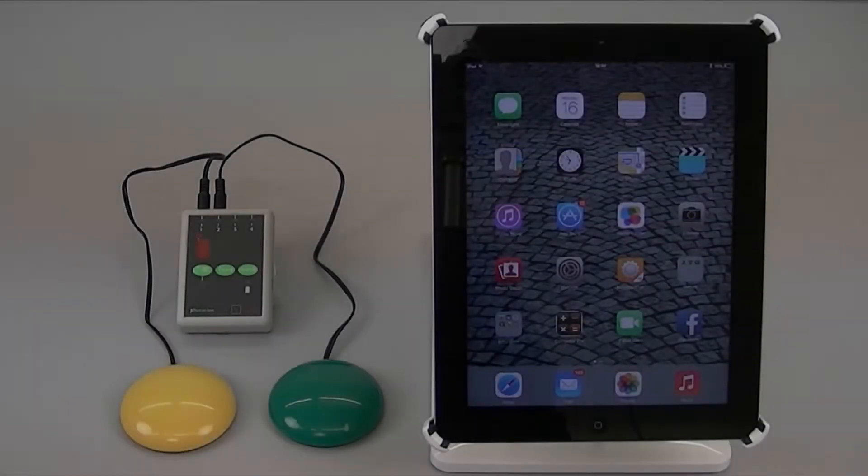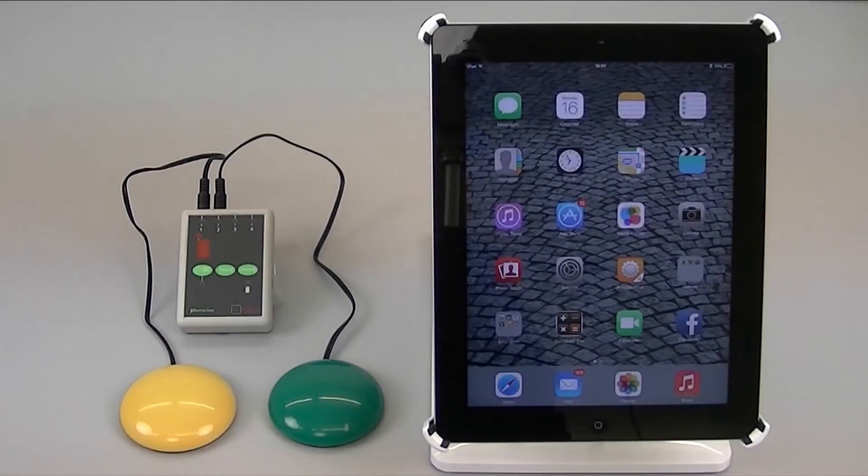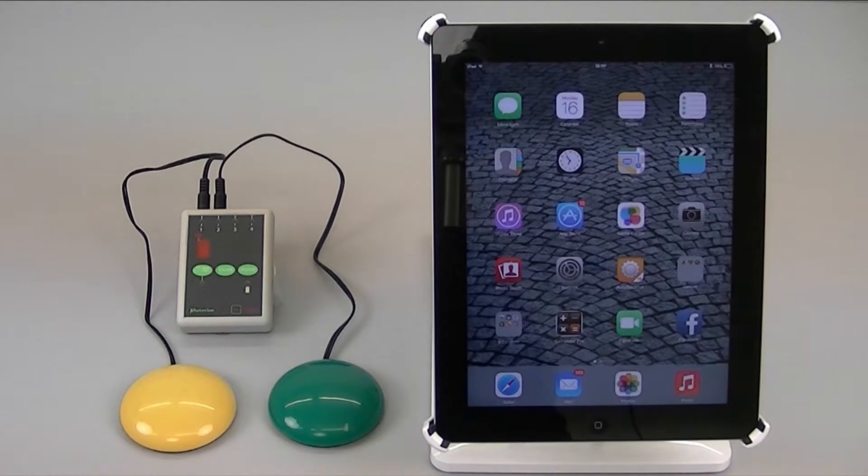Although this configuration works very well, the problem is I'm back to using two switches again even for auto scanning.